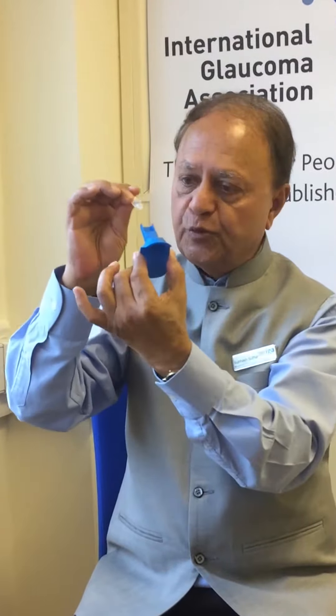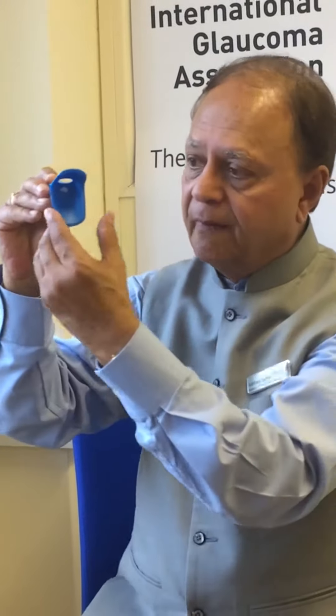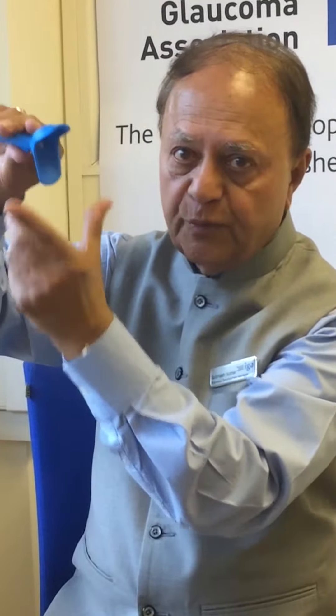Using the same principle, you break open the tape. This one is known as the Thea IOT — it's very simple to use. You can see the hole at the top and there is a slot where you push the single dose unit in, which fits in perfectly. There's a trigger at the base where you put your thumb.